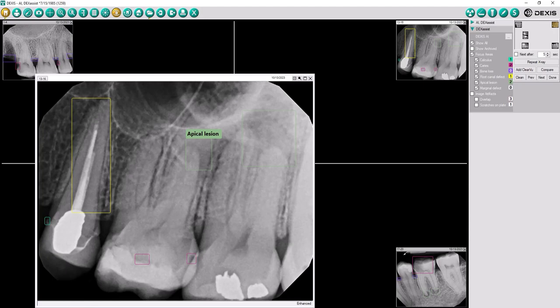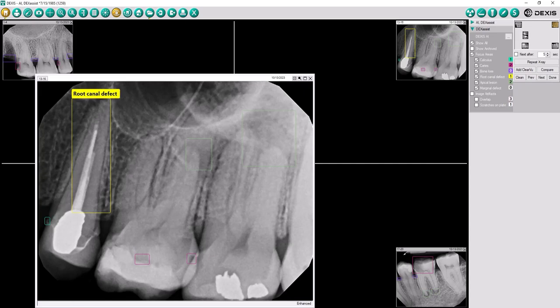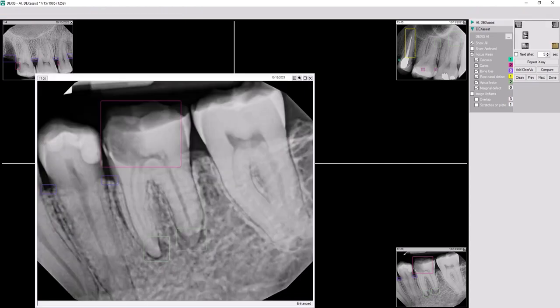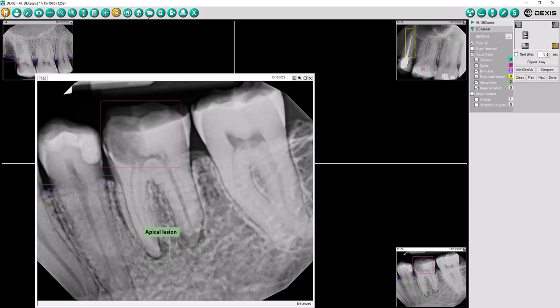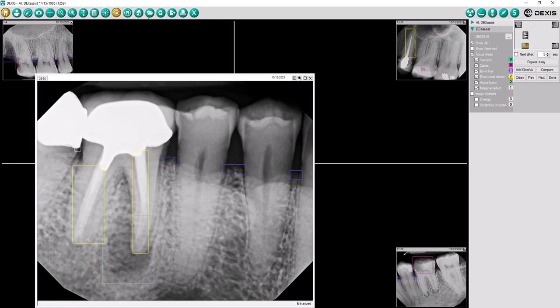The DexAssist solution seamlessly integrates into your existing DexAssist software and is compatible with DexAssist-branded intraoral sensors. It will automatically populate as soon as you have completed your x-ray series.